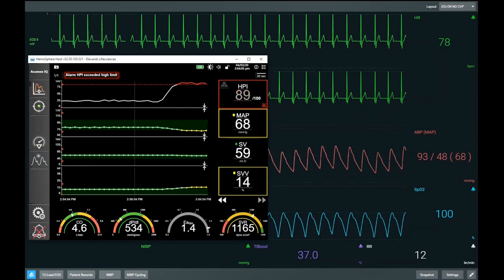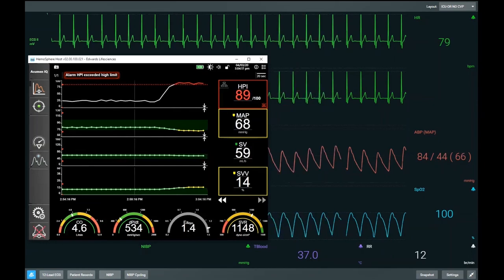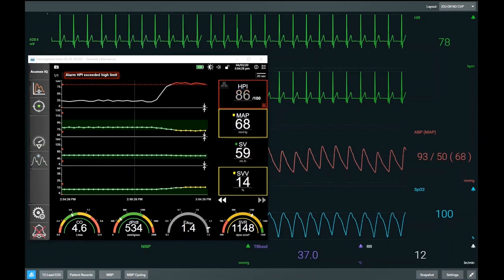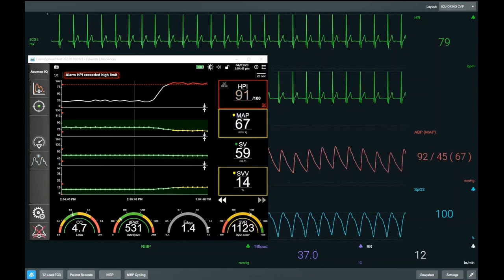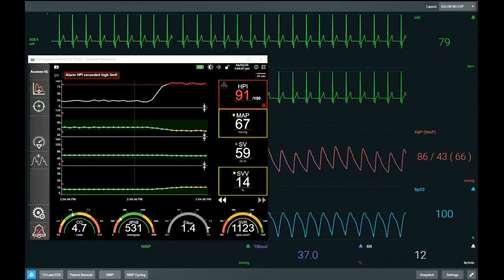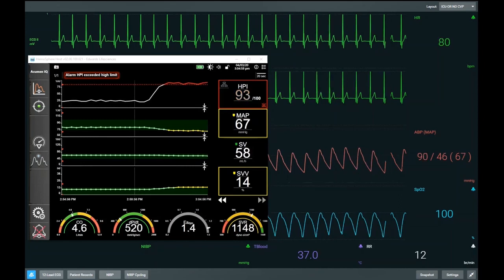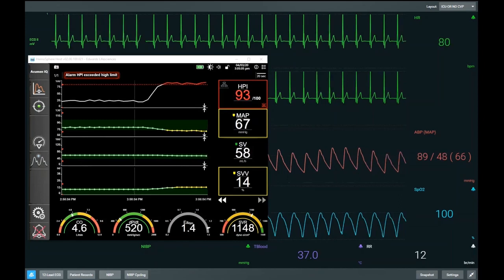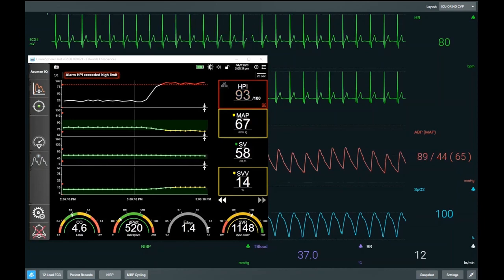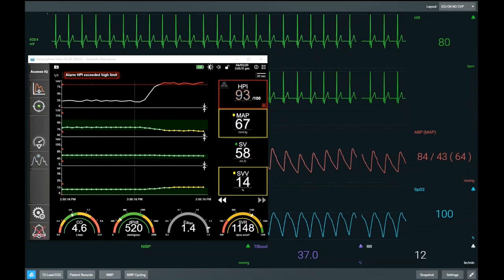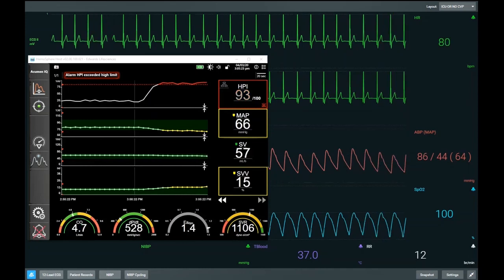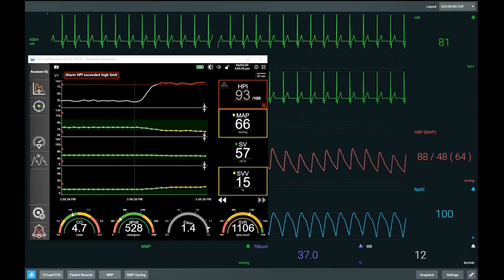If certain criteria are met, Eadyne can predict whether a patient will increase their blood pressure in response to a fluid bolus. The criteria include: the patient must be preload responsive — our SVV is 14, so that's met; the patient must be trending towards or be hypotensive — our HPI is raised at 91, so that's met; and Eadyne must be greater than 1. If all criteria are met, we predict a patient who will be a pressure responder. However, it's important to remember there is a gray zone with Eadyne, approximately 0.8 to 1.2.